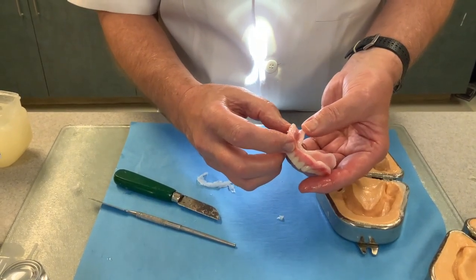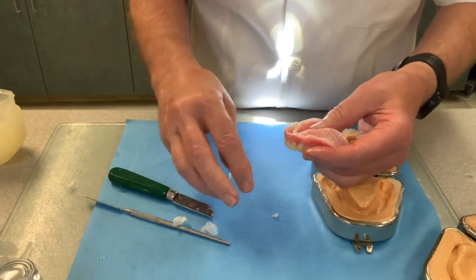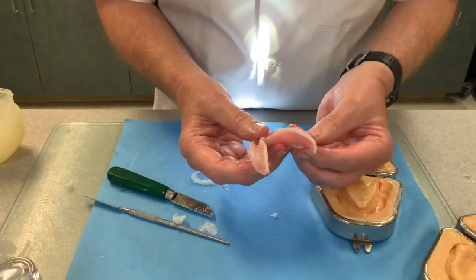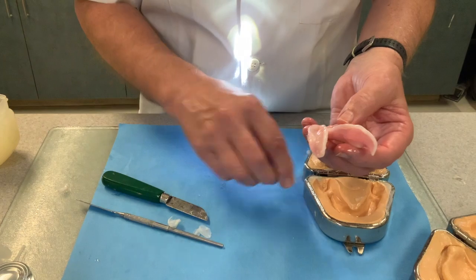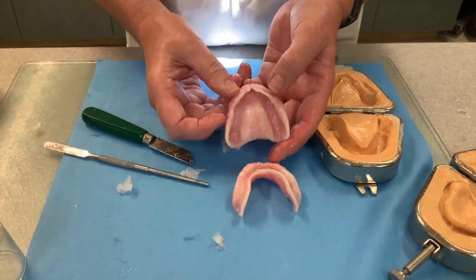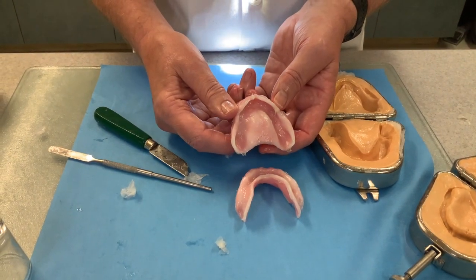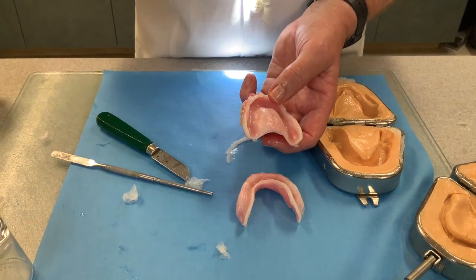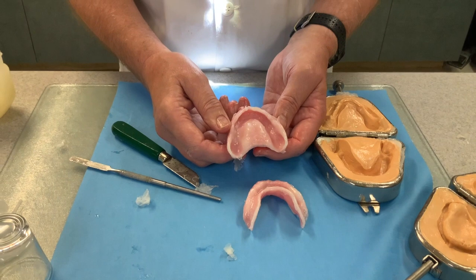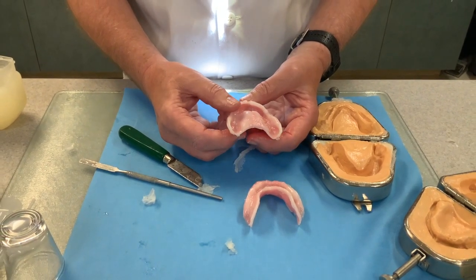I will say Dr. Turbyfield and Dr. Pound would be telling me not to do that, but the newer flow-cast material responds beautifully to that closed system. You can't get it much better than that, and it really took us only about 10 minutes. We've got her provisional, her bite record, her face bow. I'm going to leave it up to Charlie to fabricate her finals, and I'm going to go slip these in her mouth and let her wear them while we're working.